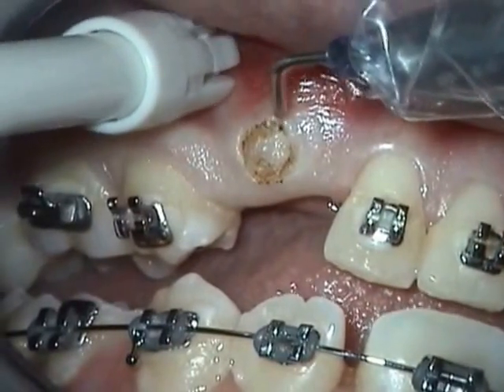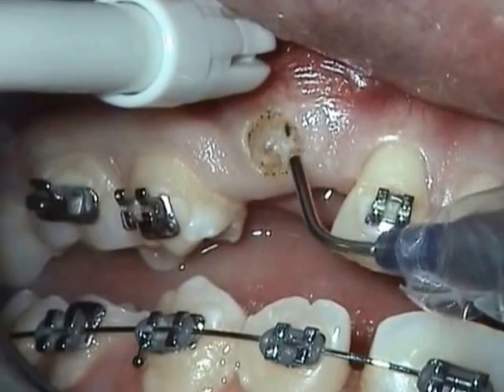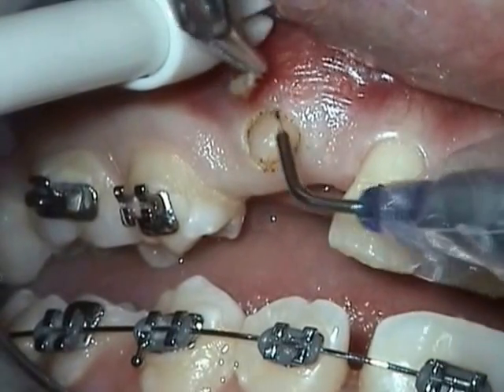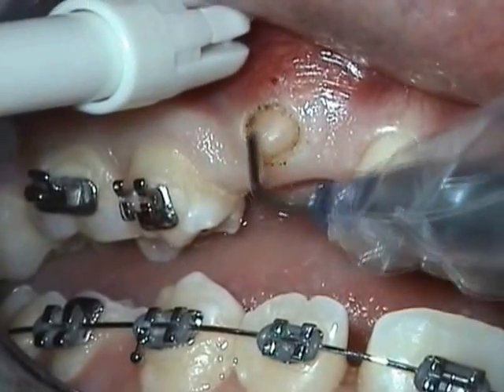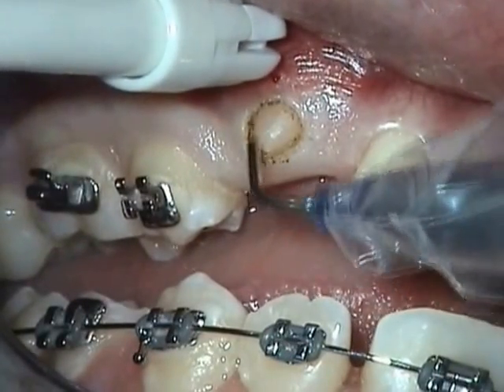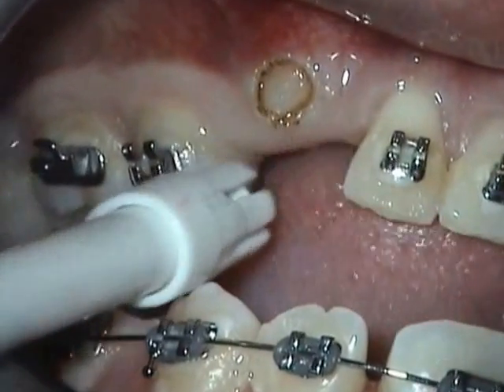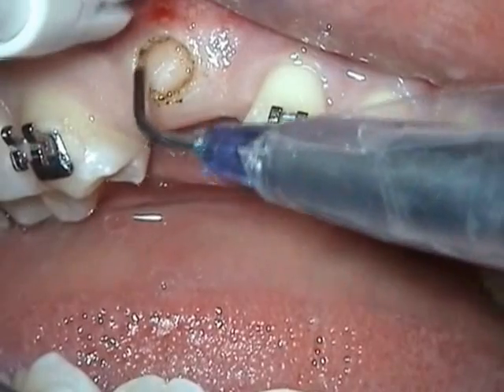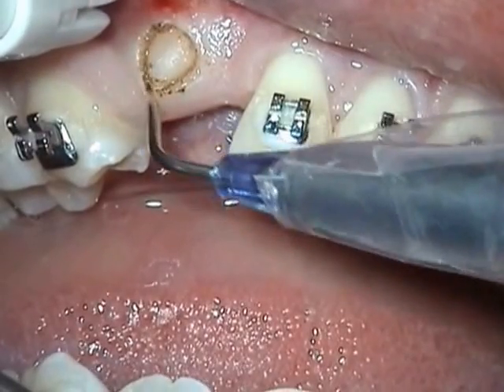Use a tissue forcep to lift up the tissue and finish the margin using quick sweeping motions.